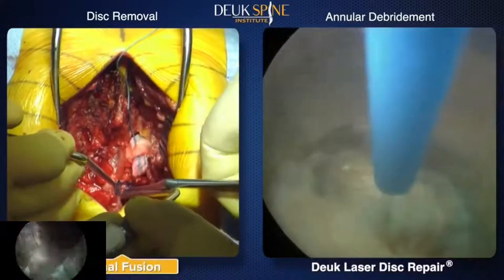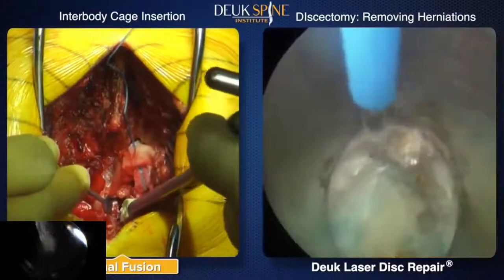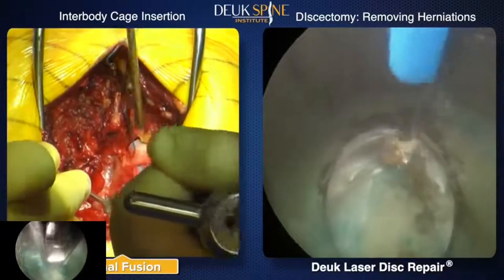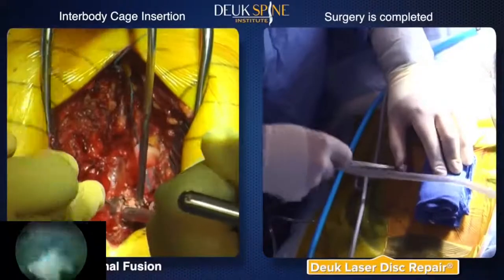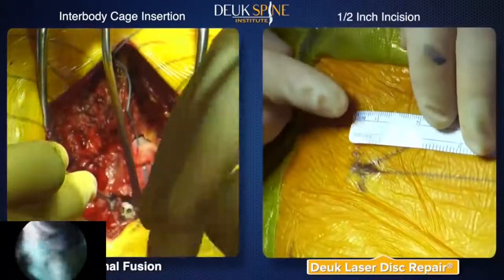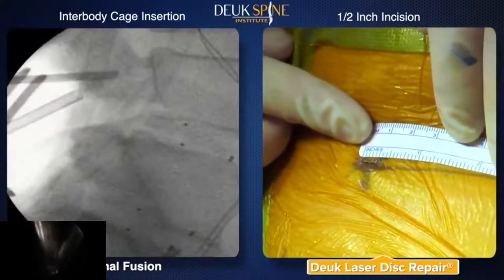After the fusion patient's damaged discs are removed, a metal or plastic cage housing bone grafting material is inserted in place of the removed discs. Once the laser has removed the painful part of the annular tear, the endoscope and tubular retractor are removed, leaving less than 1/2 inch incision in the skin, which is closed with a single stitch, steristrips, and a Band-Aid.